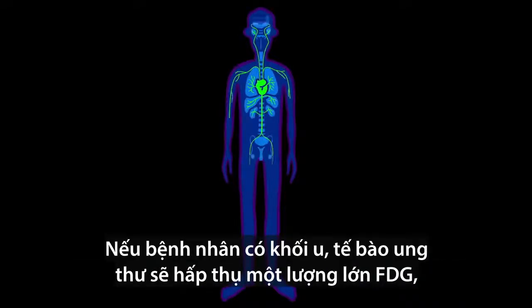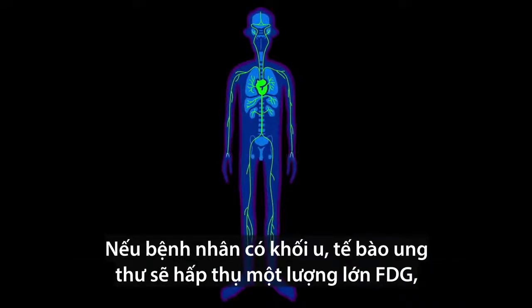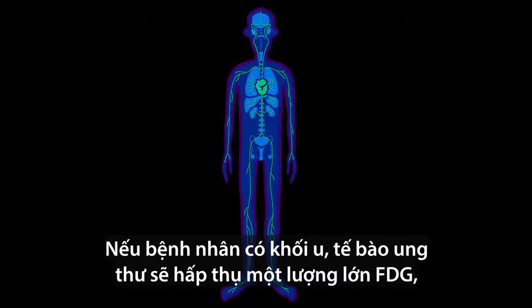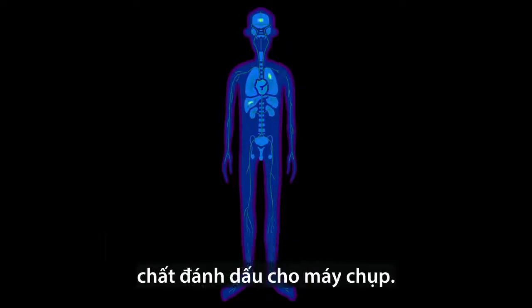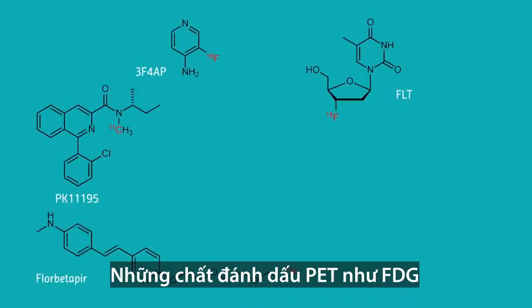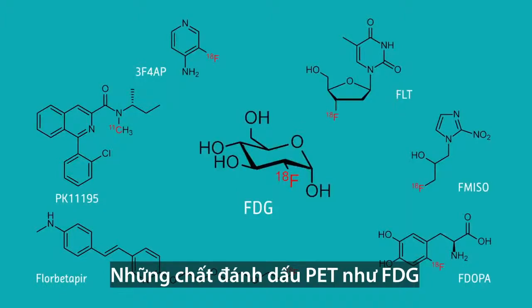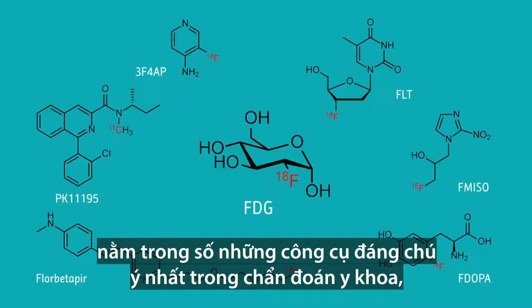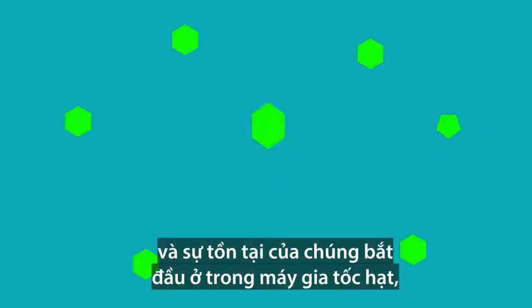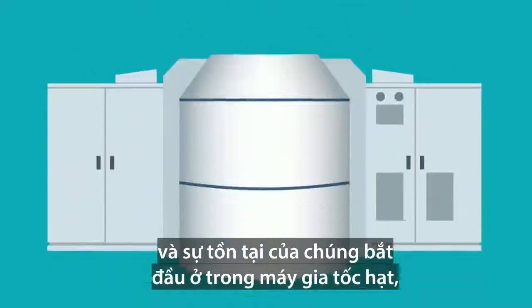If he has a tumor, cancer cells within it will take up a significant portion of the FDG, which will act as a beacon for the scanner. PET tracers such as FDG are among the most remarkable tools in medical diagnostics.